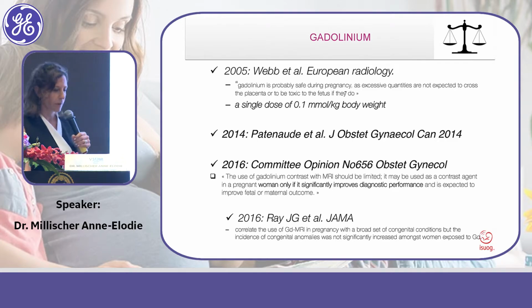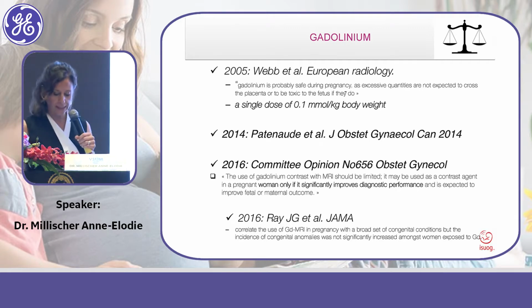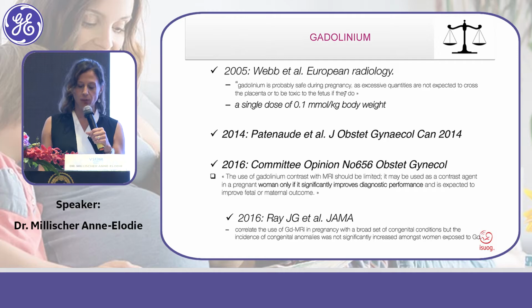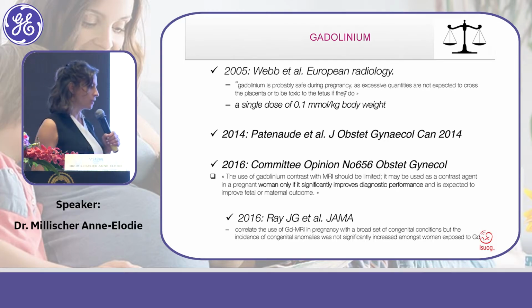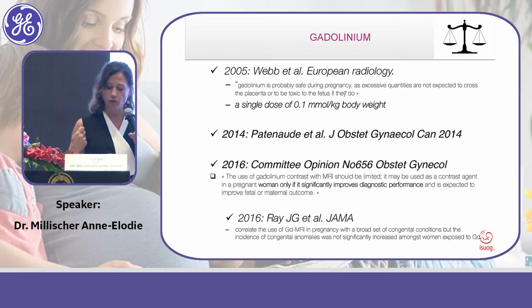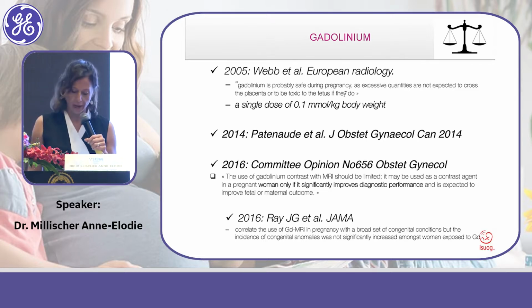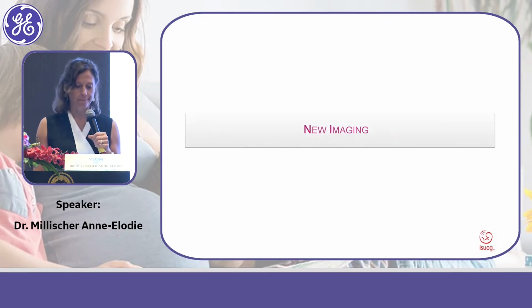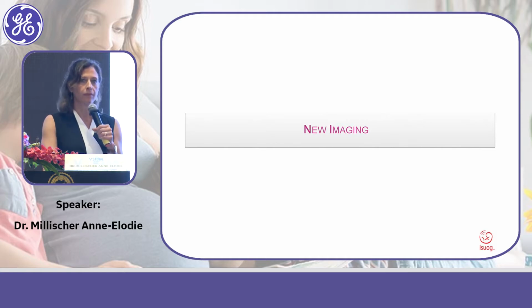But the use of contrast during pregnancy is questionable, so we have to do a balance between the risk to do contrast in a pregnancy and the risk for the mother to have a placenta accreta. Và nhưng mà cái việc mà tiêm thuốc cản quang vào nó vẫn còn là vấn đề rất là tranh cãi, cho nên nhiều khi mình phải cân nhắc giữa cái lợi và hại của mẹ và của bé để có quyết định tiêm thuốc hay không.